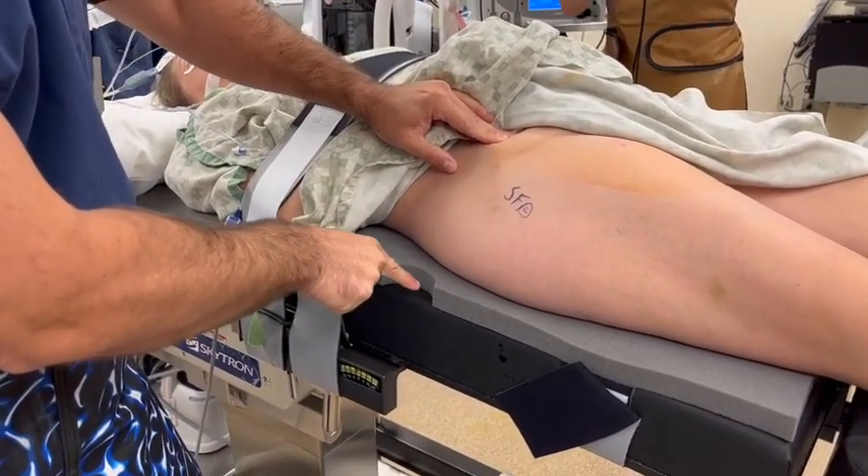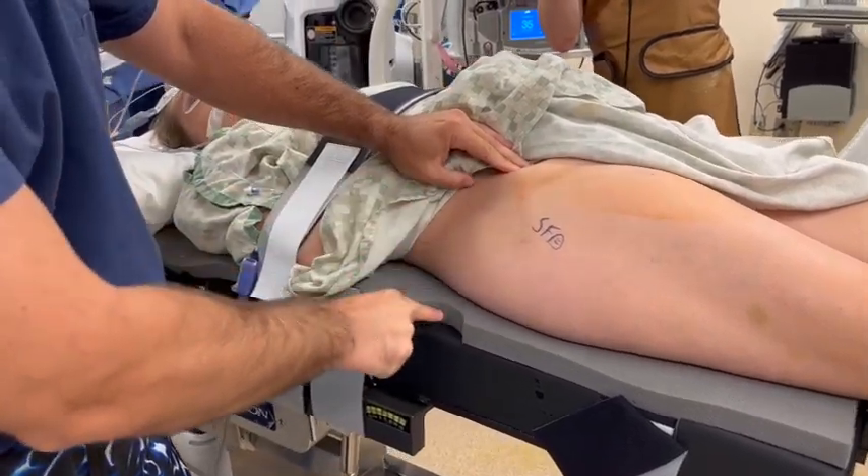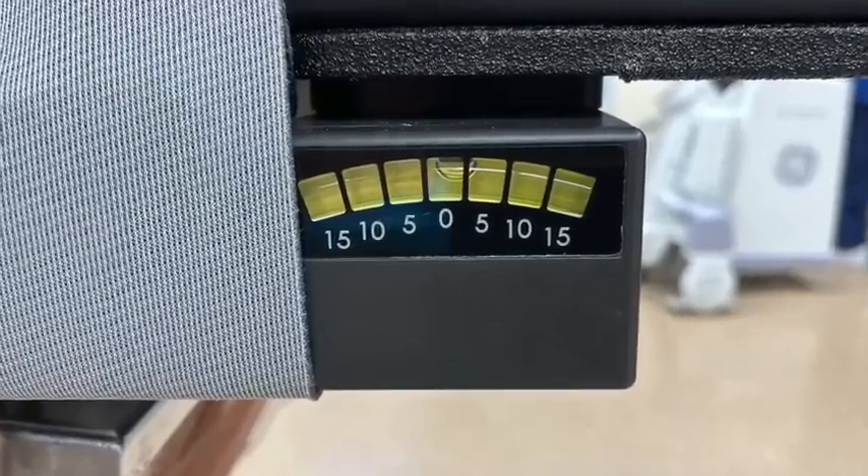The patient is distal enough that the ASIS is at the distalmost aspect of the half-circle cutout in the traction pad. The bed is set to 3 degrees of Trendelenburg positioning.